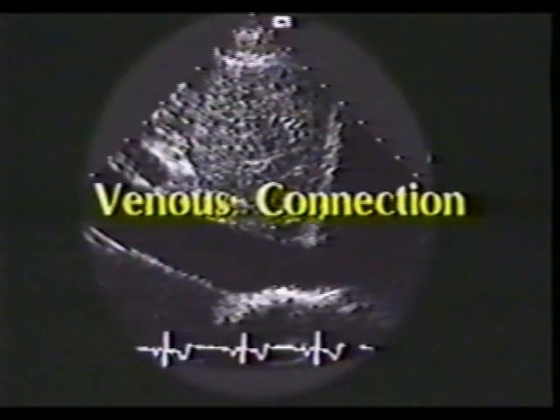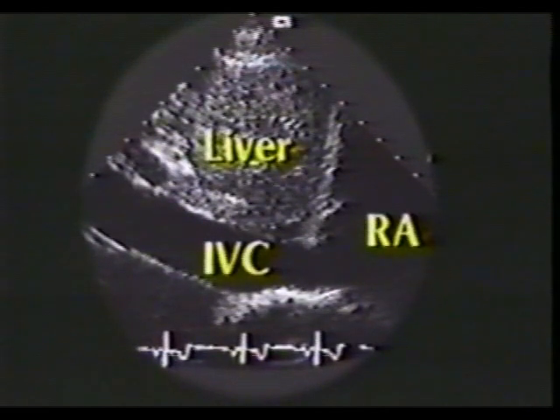The great veins and the venous connections are best defined utilizing the subcostal and suprasternal positions. This is the long axis view of inferior vena cava. The inferior vena cava connection to the atrium can be readily identified, and usually, but not invariably, this identifies the atrium as the right atrium. In similar manner, the pulmonary venous connection to the atrium usually will identify it as the left atrium.